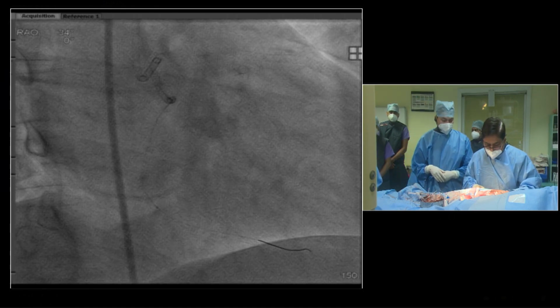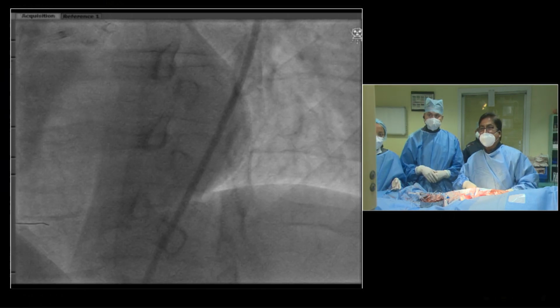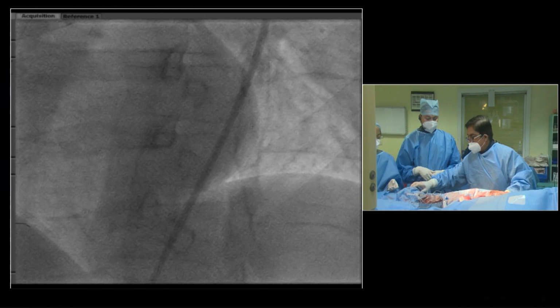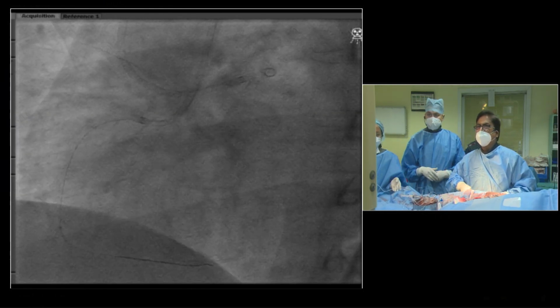Here the toughest situation was the proximal cap. Then switching over, as Aftab Khan told, redirecting the wire was an ideal situation in this case, and so the Gaia gets redirected beautifully. People were asking why you did not use a Gaia 3 wire.